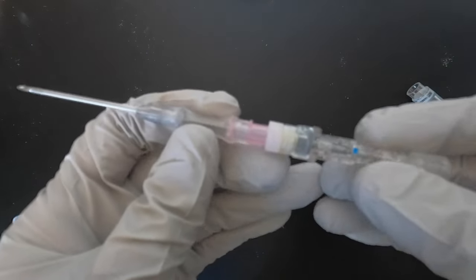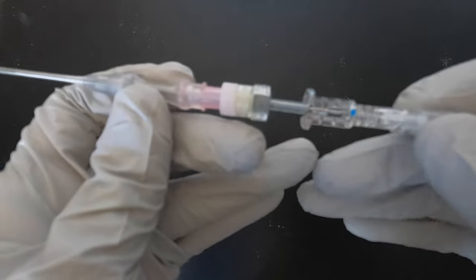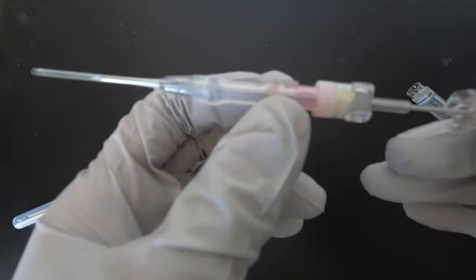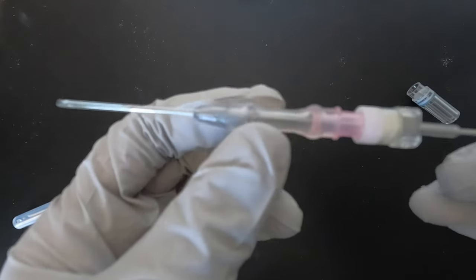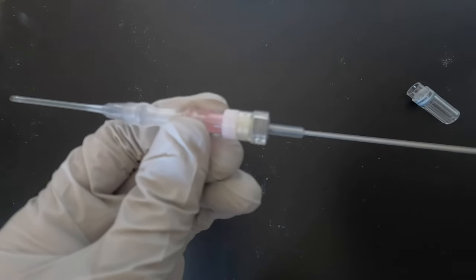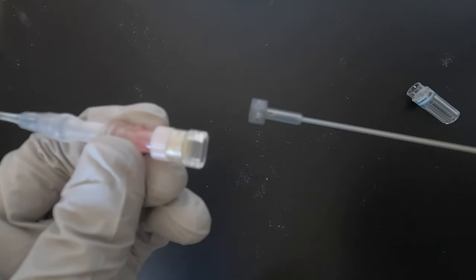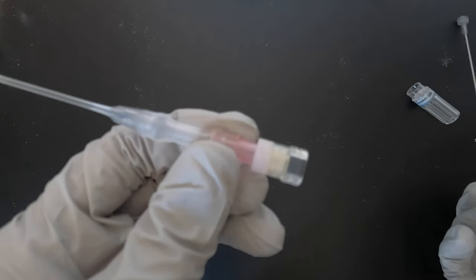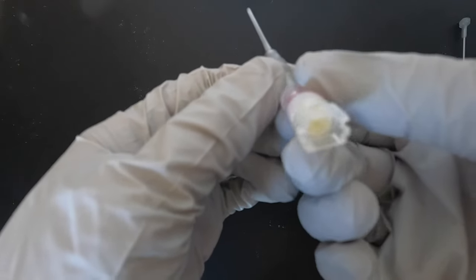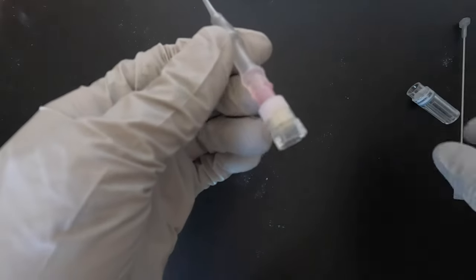When you cannulate and you're already in the vein, just retract the sharp part here. What will be left is the plastic cannula side. I'll show you how it looks when you retract the needle — it's automatically sealed to prevent sharps injury. This is what remains in the patient's arm or in the fistula after removing the sharp.